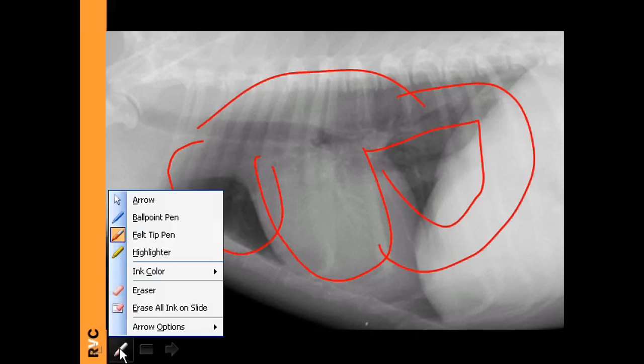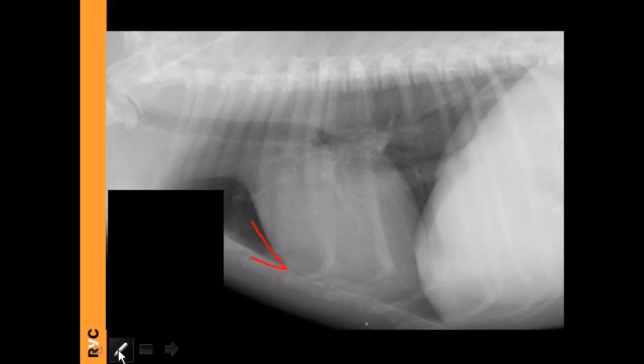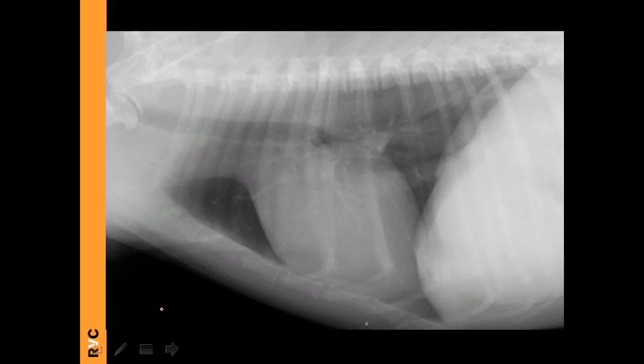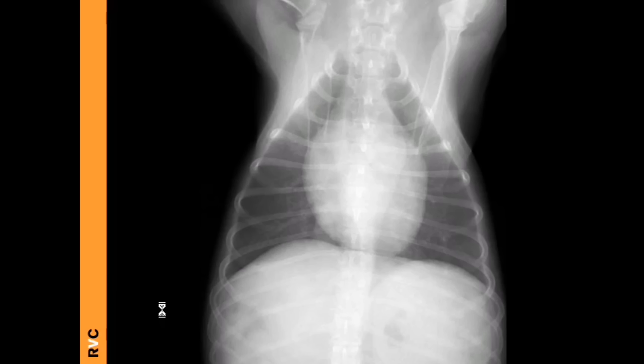Fissure lines can be seen if there is thickening of the pleura or fluid in the pleural space. The lung lobes normally have a nice pointy margin. We can sometimes identify bronchi — which should not be thick — and vessels that we can measure.